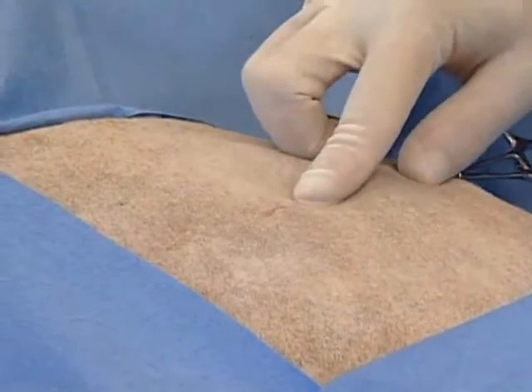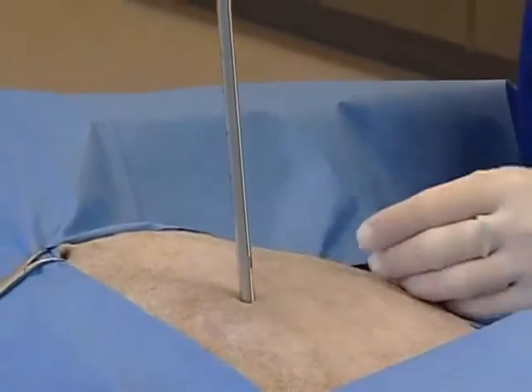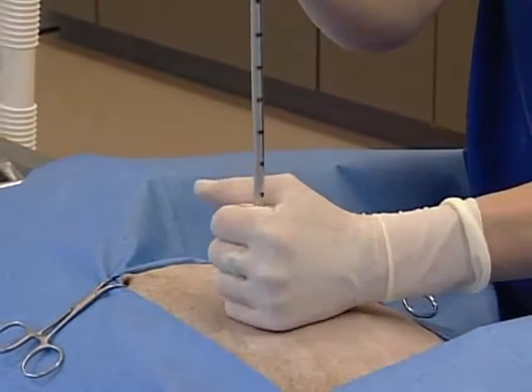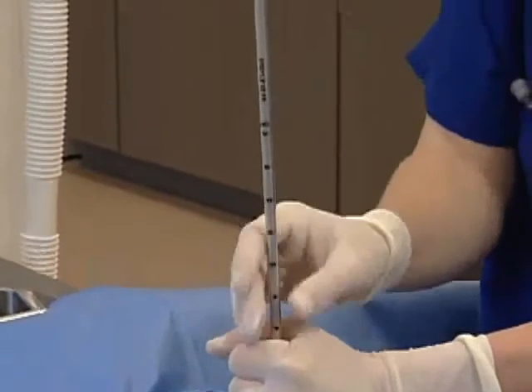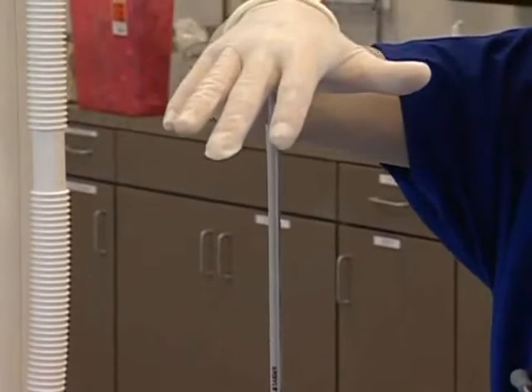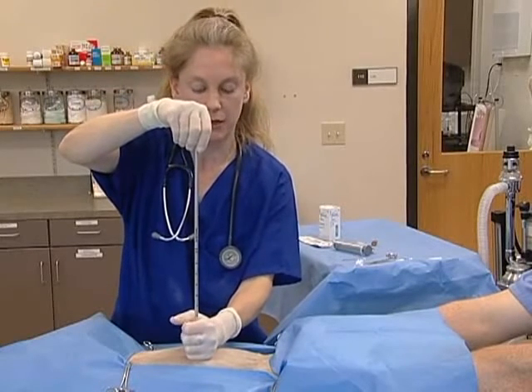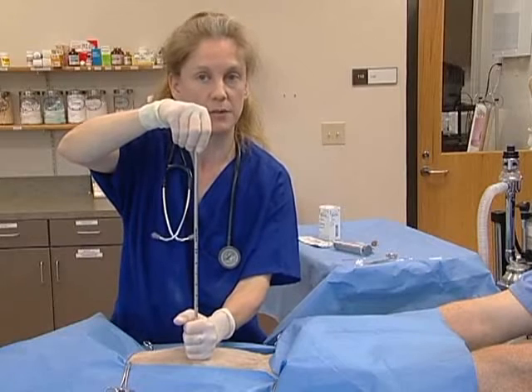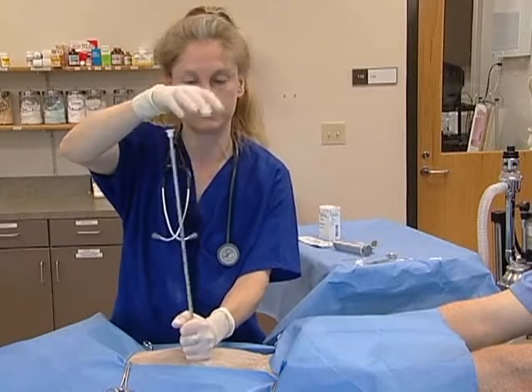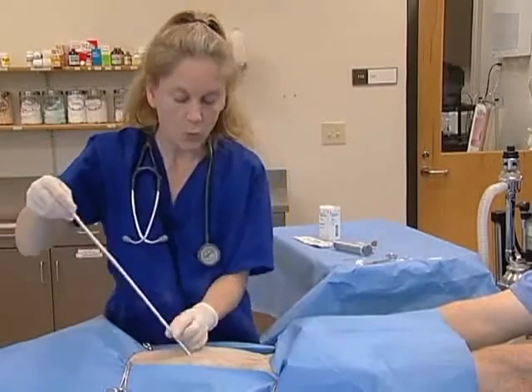Once you've made that incision, take your chest tube and place it perpendicular to the patient and the table with the trocar directly against the subcutaneous tissues. Grasp the chest tube firmly with your dependent hand, and with your superior hand punch the chest tube through the chest wall and into the pleural space. Grasp the tube firmly with your dependent hand so that you halt its advancement and do not penetrate lung tissue as you're inserting the chest tube.